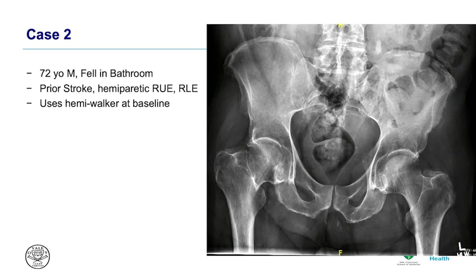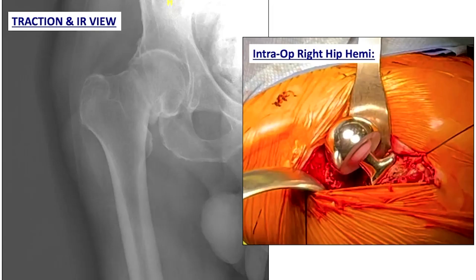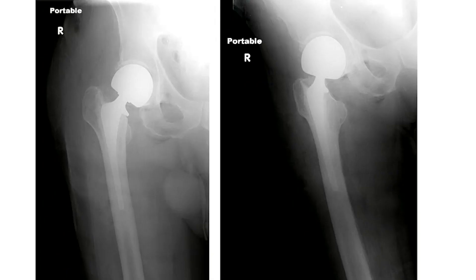Case two: similar presentation — fell in bathroom, prior stroke, osteoporotic, hemiplegic at baseline. A lower-functioning patient who is going to get that cemented stem. This is a nice view showing the capsular limbs being reflected. I have a bipolar head here — to reduce it I tip the head backwards, use the head pusher going down, and with the limbs of the capsule on tension I move the leg slowly as my assistant pushes the head in so it mates beautifully into the acetabulum.